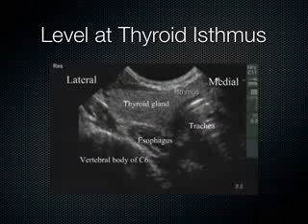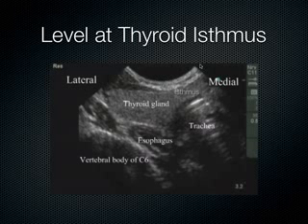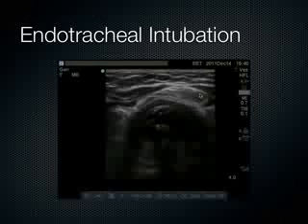And so on ultrasound, we can make out here, using a curved transducer, although they turn it up to the resolution mode, high frequency mode, so you get a little bit more penetration. You can actually see all the way down to the vertebral body here of C6. We can see the thyroid gland here. We can see the esophagus just off to the left side of the trachea seen here. So this is medial, this is lateral, and this would be the left thyroid gland seen here.